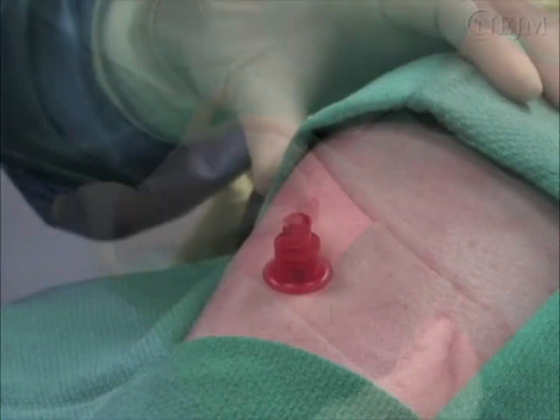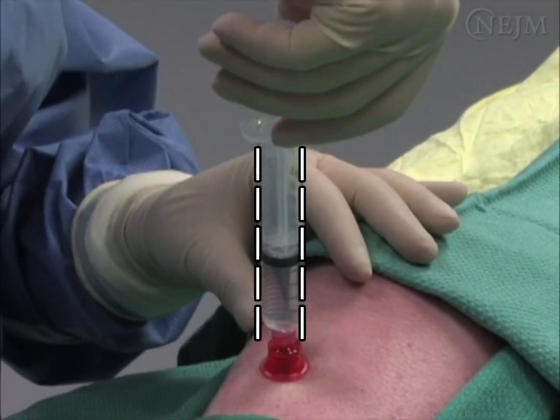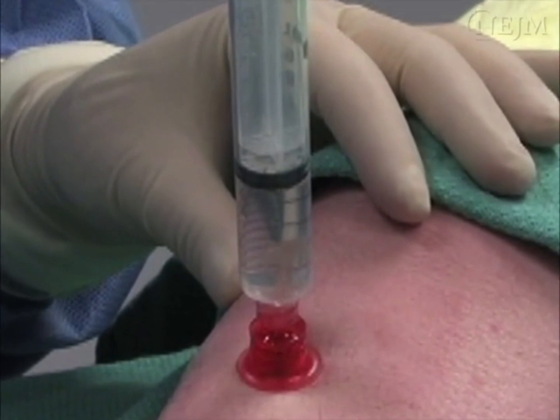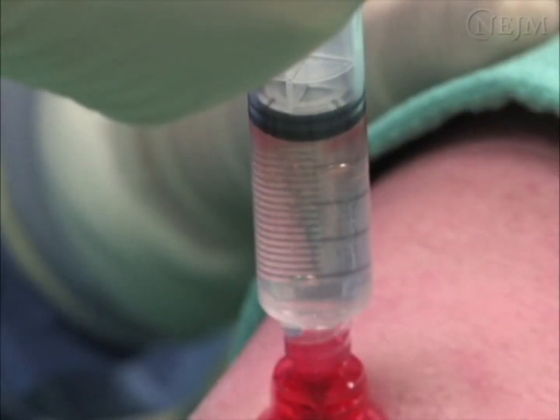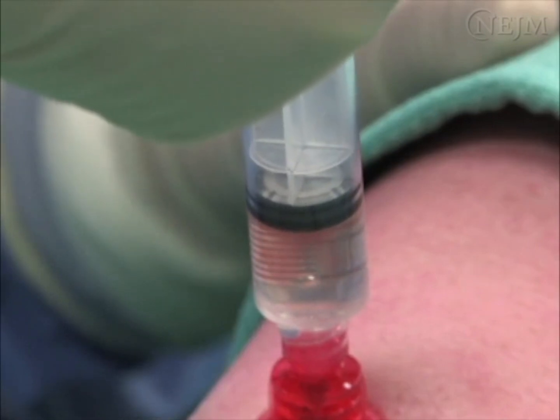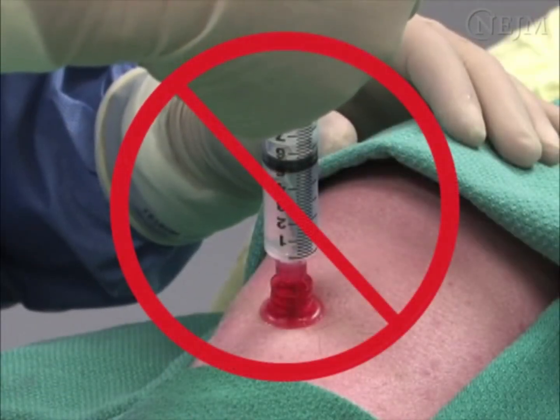Remove the stylet and connect the needle to a 10 cc syringe with a standard Luer lock connection. If the needle is correctly placed within the marrow cavity, the syringe should be able to stand upright without support. Aspiration of blood and marrow confirms adequate placement of the needle, but it is not always possible to aspirate marrow, even with adequate placement. Obtain confirmation of placement by infusing a 10 cc bolus of saline solution through the syringe. The fluid should flow easily with no resistance. If the fluid does not flow, select another insertion site.